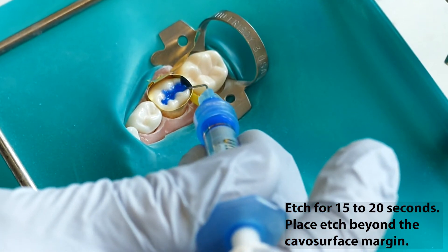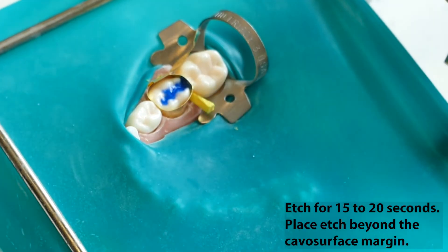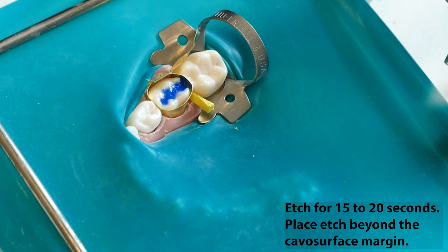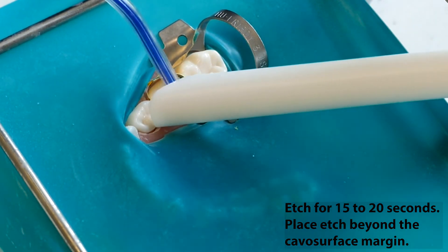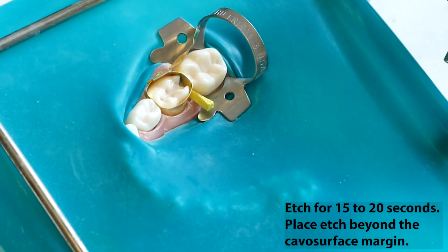The preparation should be etched for 15 to 20 seconds. Be certain that the etch extends well beyond the cavosurface margin and covers any susceptible pits and fissures not included in the preparation. Rinse the etch out. Scrub in the Consepsis and then scrub in the bond and light cure.